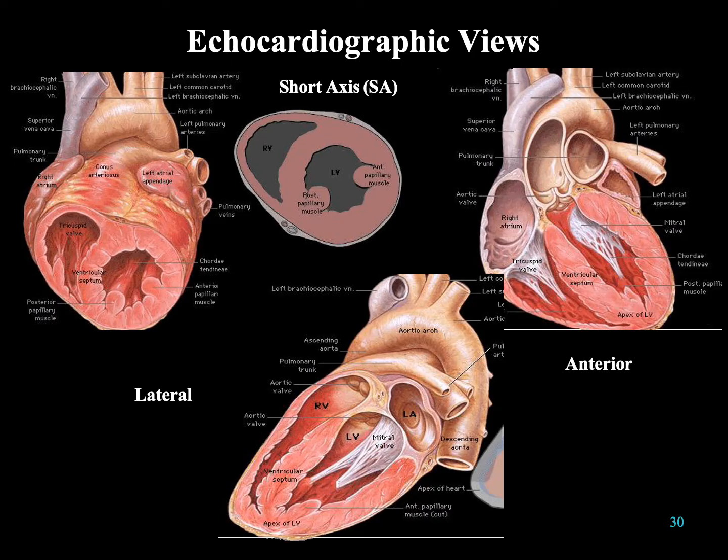So there's some views of what they'll be looking at, so I can actually see the function here on a short axis, lateral, anterior.